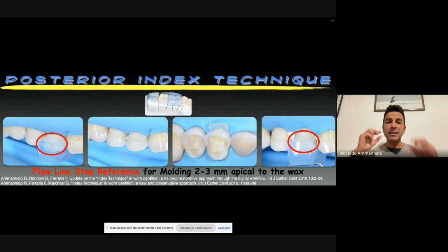So the project was that on the four posterior sextants, I molded the two premolars and the second molar, while the first molar is one of the glass ceramic restorations that I call the four table legs that stabilize the occlusion from a static and dynamic perspective. So here again, we see the stabilizers, the flow lines, and we check them also with the matrices in place, and you see that if no interferences are there, the key is kissing the flow line.